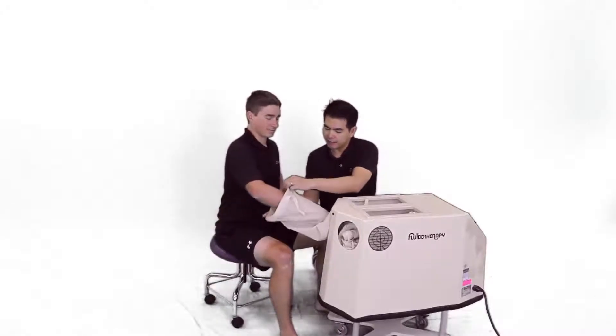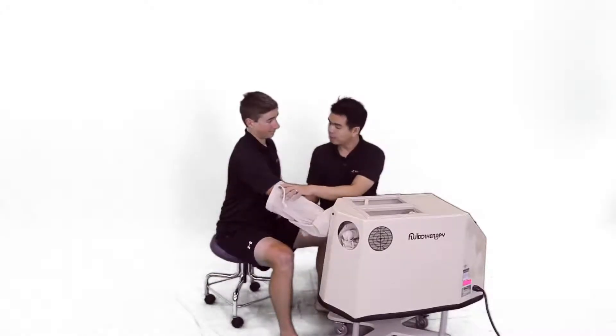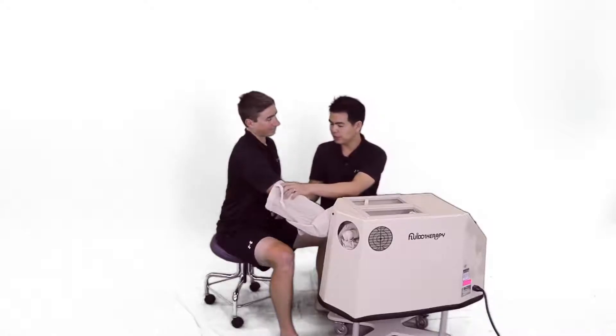As you are in the Fluidotherapy, it will be nice and warm. I want you to gently move your wrists and your fingers to exercise, okay?